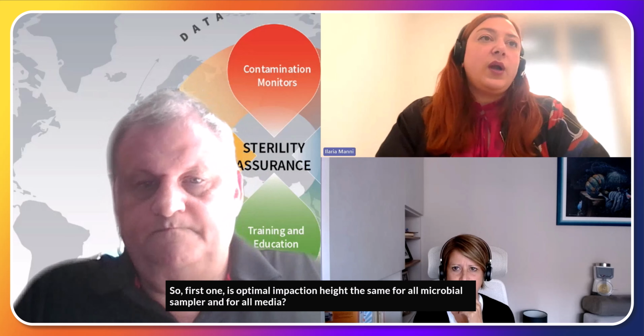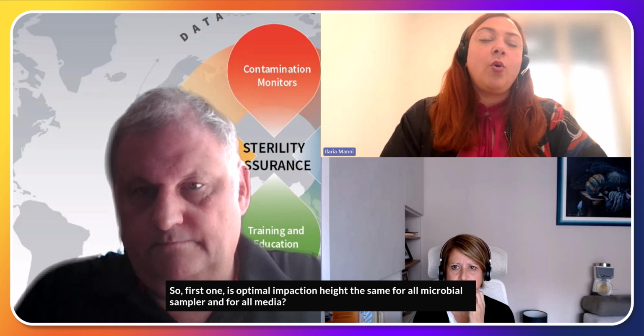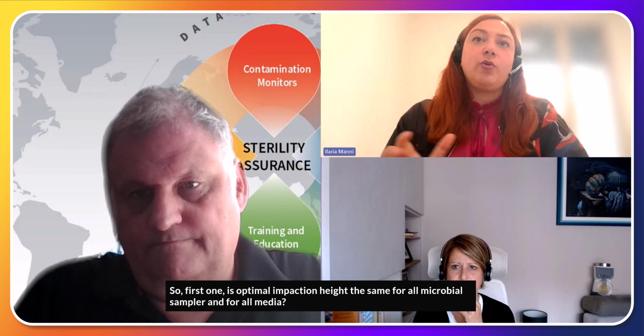So first one, is optimal impaction height the same for all microbial samplers and for all media? Well, no, I think I touched on that a little bit. For us, we have a fixed slit width, so the only variable for us would be the height, that 0.5 to 1.5 millimeters.